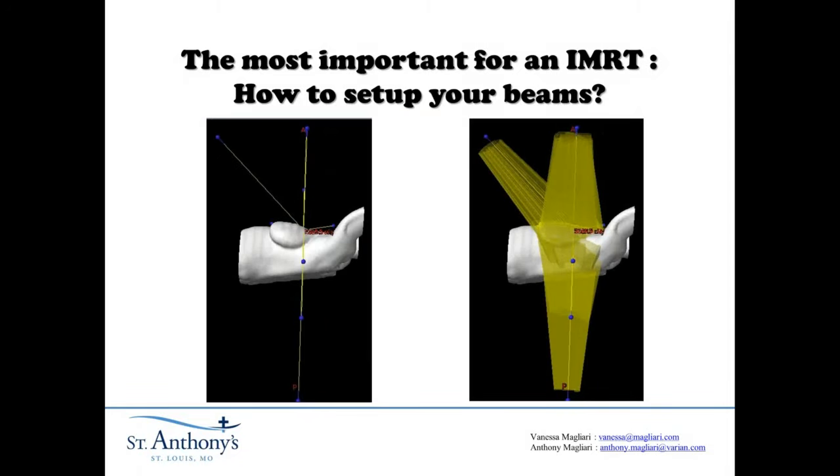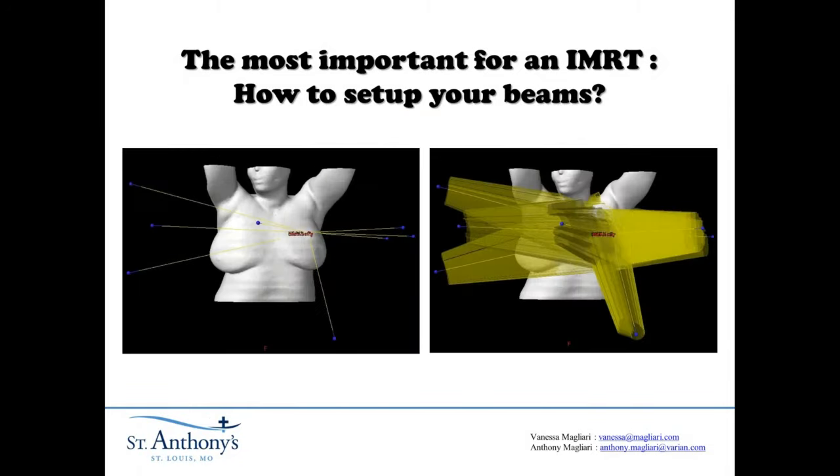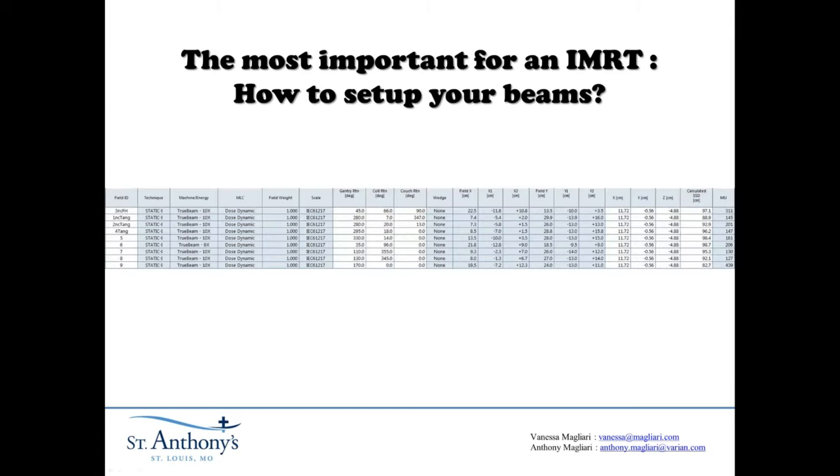Here is another 3D view of the beams. You can see the non-coplanar beams and the rest of the beams spread out. Here is the entire beam arrangement — again, this is specific to this particular patient, just like all of your beam arrangements should be. I'll go over a more generic approach to making a coplanar beam arrangement at the end of this presentation.